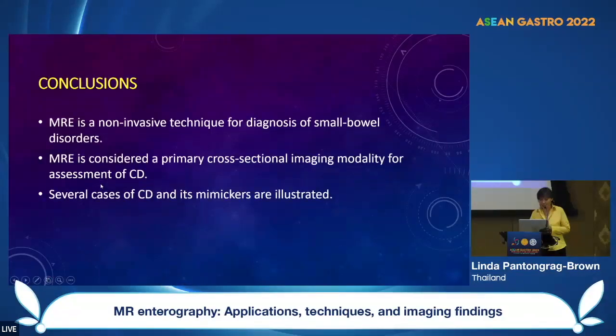So in conclusion, MR enterography is a non-invasive technique for diagnosis of small bowel disease, and it is considered a primary cross-sectional imaging for assessment of Crohn's disease. And I showed you guys several cases of mimickers that I hope entertained you somehow. If you did not learn anything, at least entertainment.